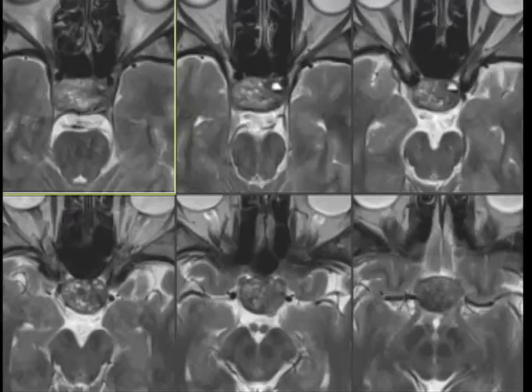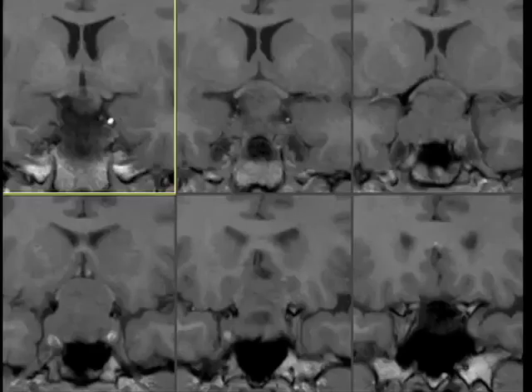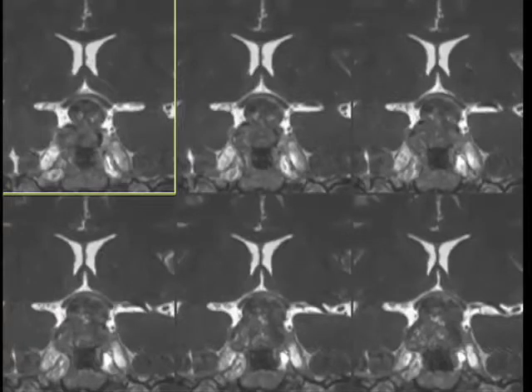And it also has some heterogeneity, which may contain some hemorrhagic focus. This is the sequence in which you can see the optic chiasm very well. So you see the mass, and the mass and optic chiasm are seen separately. You can see the degree of deformity and compression of the optic chiasm very well with this specific sequence.